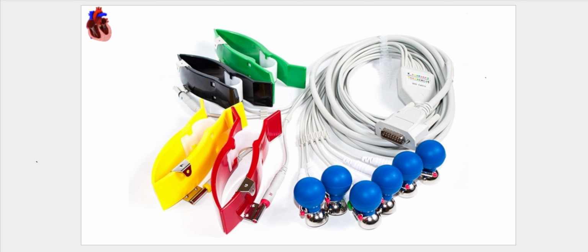As somebody who will be interpreting the ECG, you will not be over-reliant on one lead, but you'll need to use multiple leads, so that should there be a problem in specific areas or in different areas of the heart, you are able to pick that adequately, unlike just relying on one lead. These leads are attached to the body, specifically the right arm, the left arm, and the left leg.